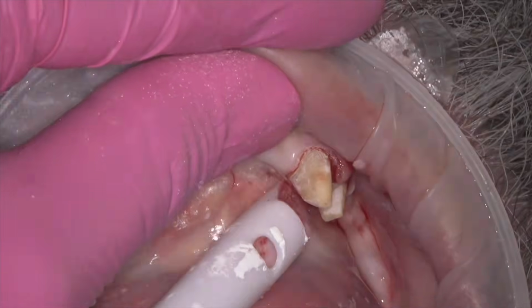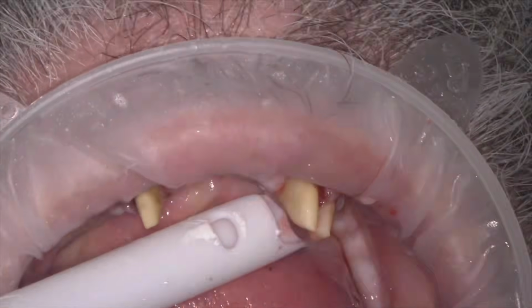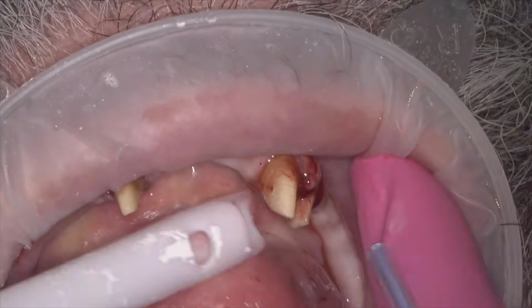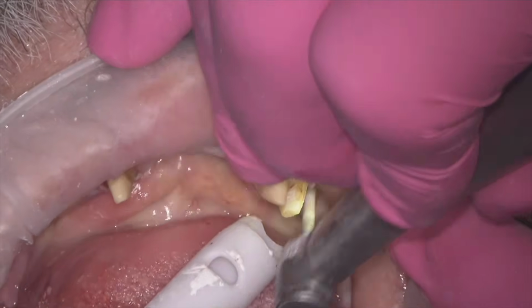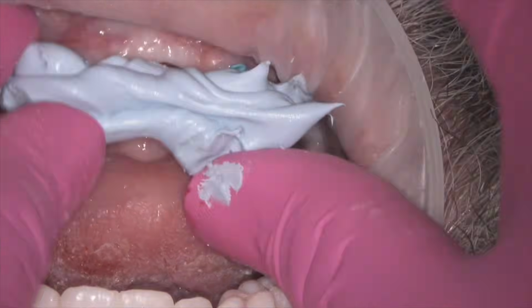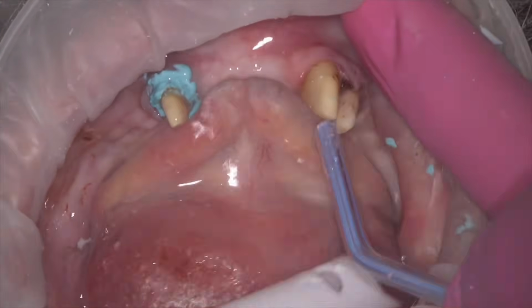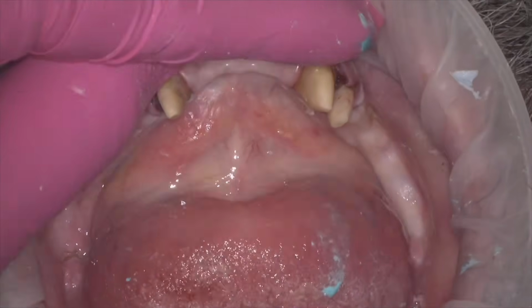And I always turn the water off and slow the speed down to about 4,000 RPMs and just do some smoothing. Aluminum chloride there, one little void in the core, smoothing that up. I'm using a bite registration to make a custom compression cap. I'm going to squirt expanding paste in there, seat the bite reg back down, and it's going to all expand into the sulcus. It's also going to stop any bleeding, and it's going to make the margins visible.